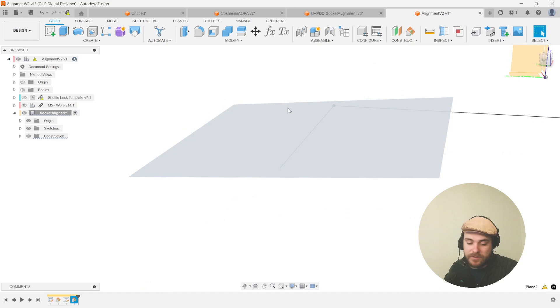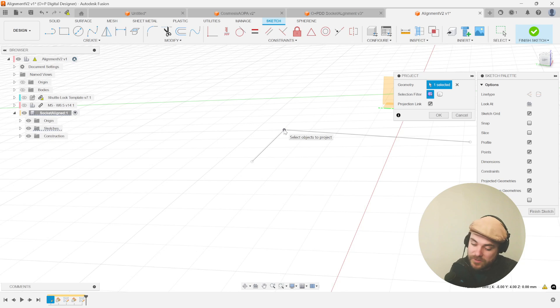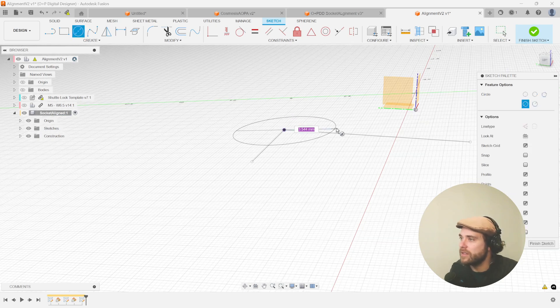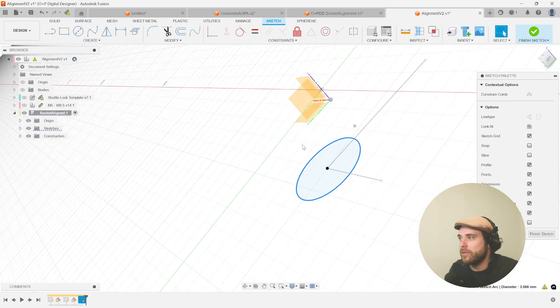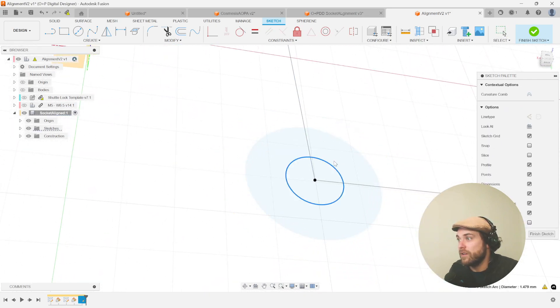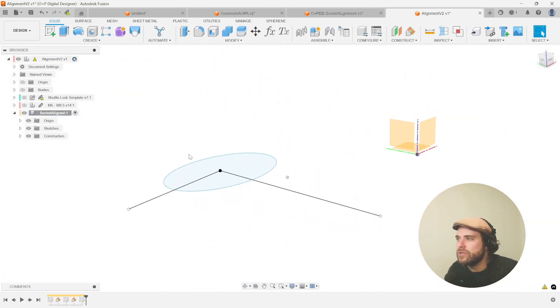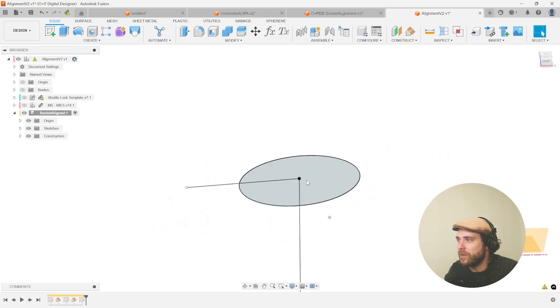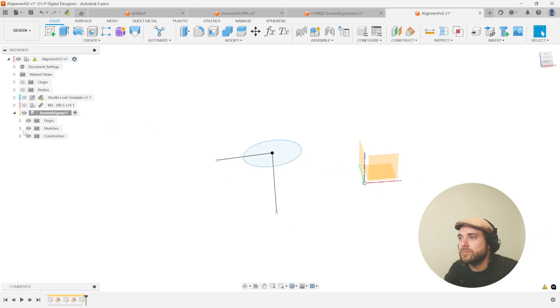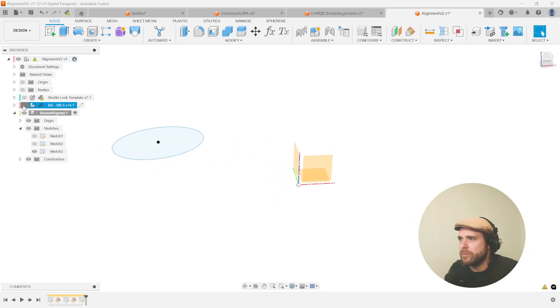Create a sketch on this sagittal plane, hit P to project that initial origin we made, then draw a circle by hitting C. This circle won't affect any geometry — it's just there to help us place a joint. Being able to call upon this circle will make it really easy to do so. Hit finish sketch and we should have a circle off to the side with angles in two different directions. In our sketches we can remove two of them and just keep this remaining circle point.